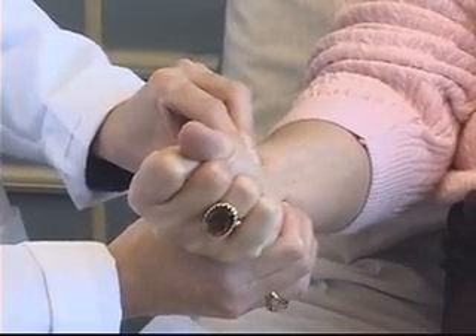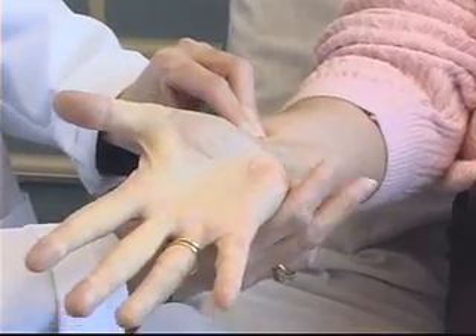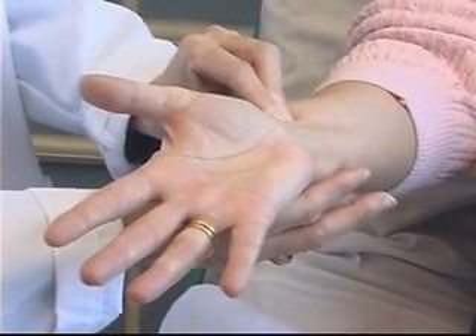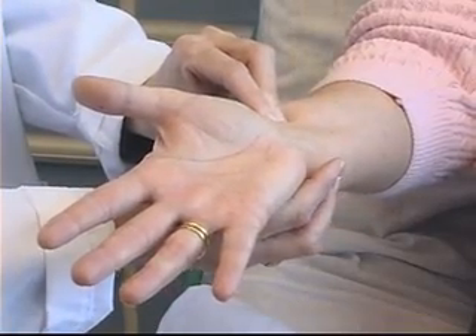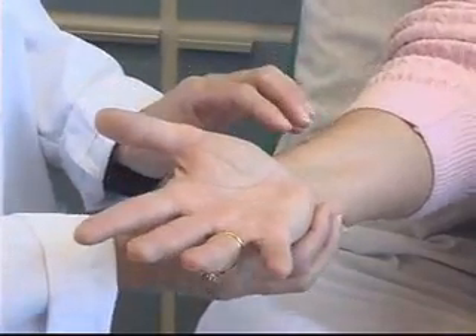After enough time has elapsed, I ask my patient to release her fist, and I release my grasp on the ulnar artery. What I'm watching for is good flow returning to that hand. The hand pinks up nicely. I now have a positive Allen's test and I am okay to proceed with the procedure.